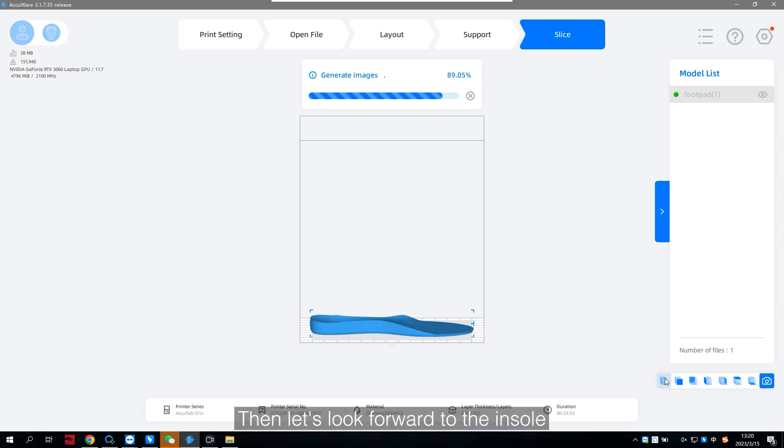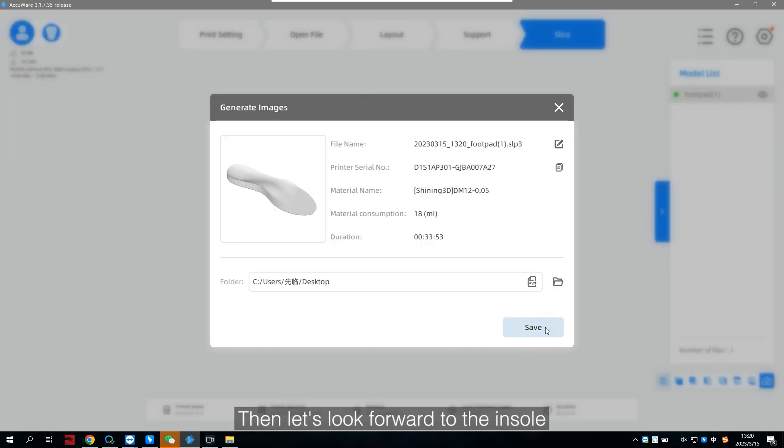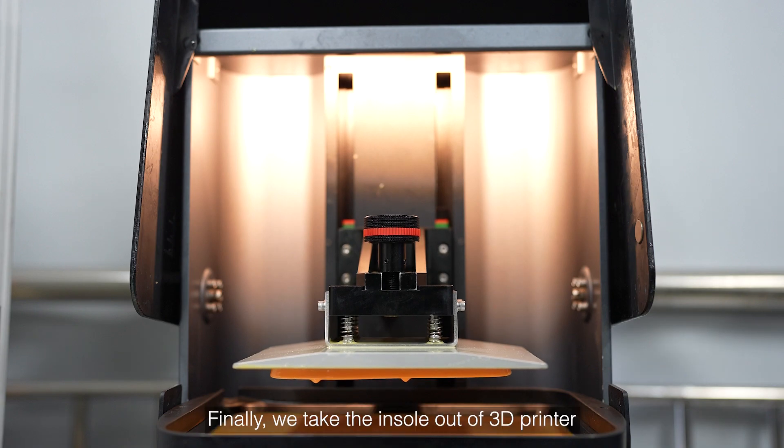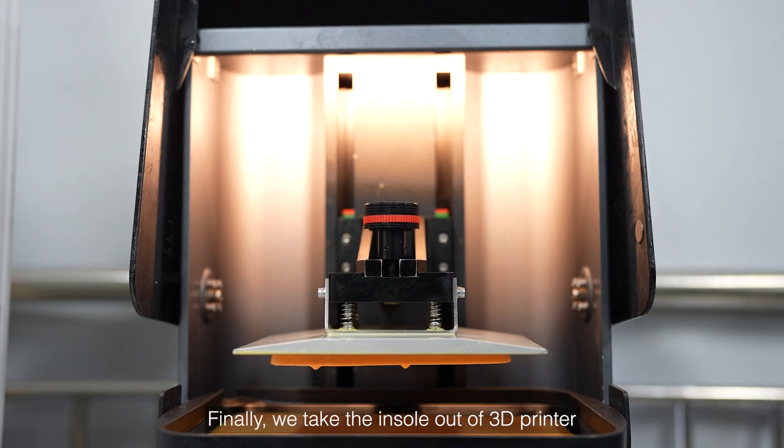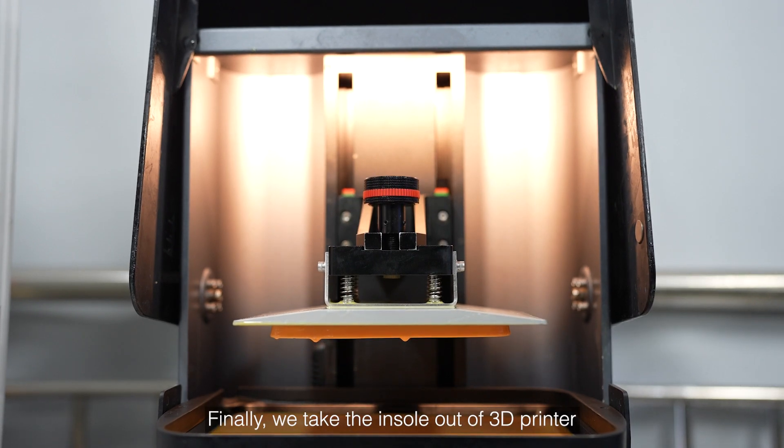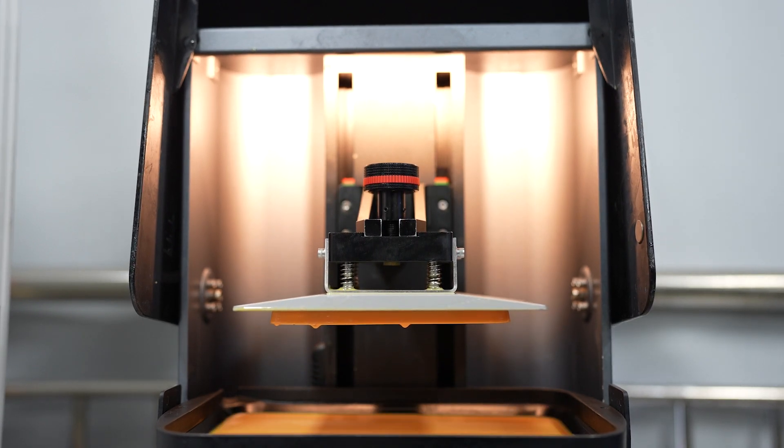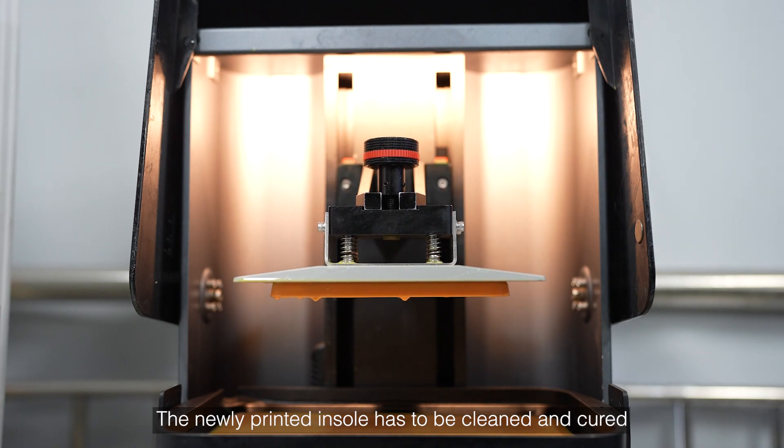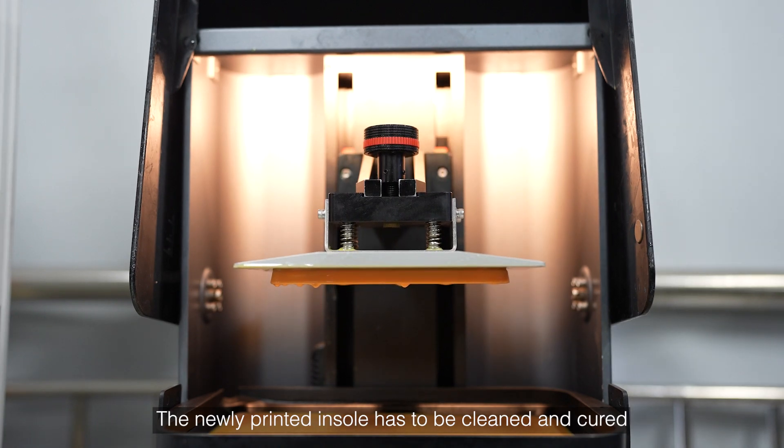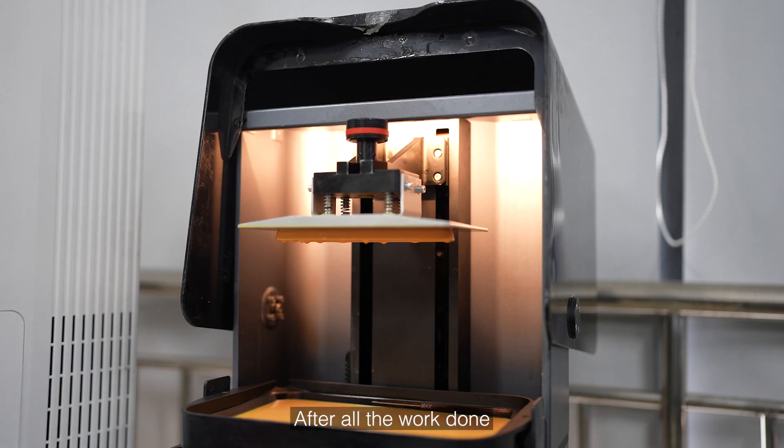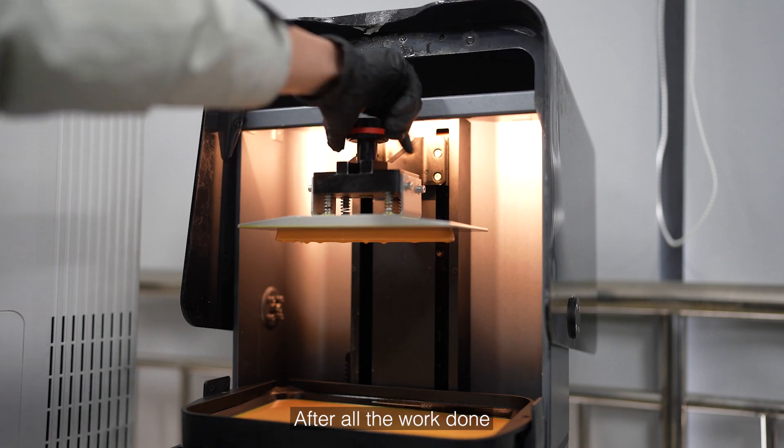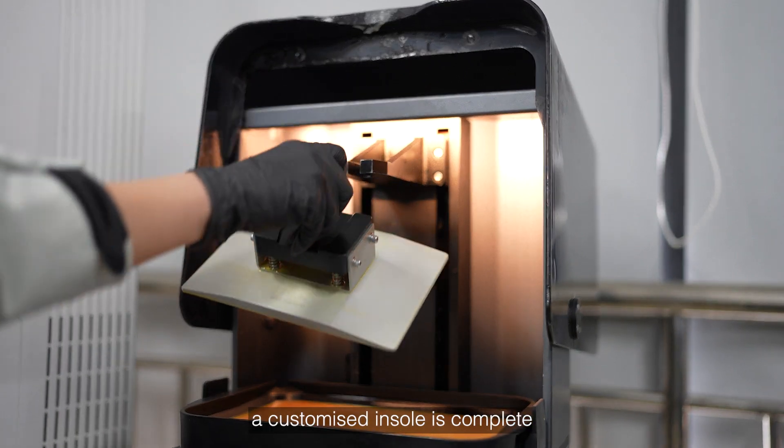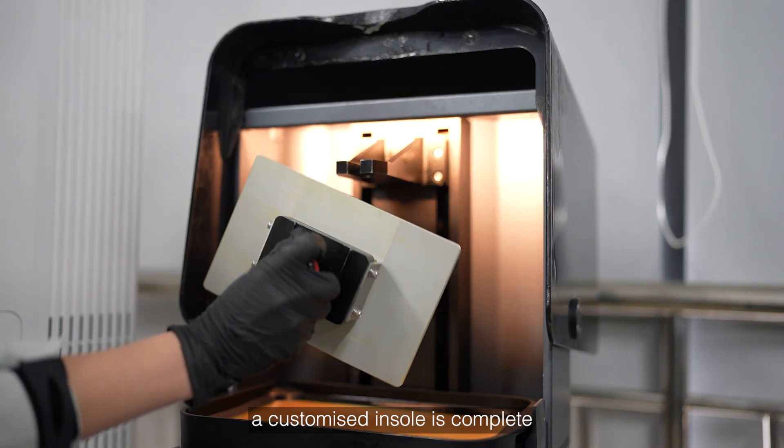Then, let's look forward to the insole. Finally, we take the insole out of the 3D printer. The newly printed insole has to be cleaned and cured. After all the work done, a customized insole is complete.